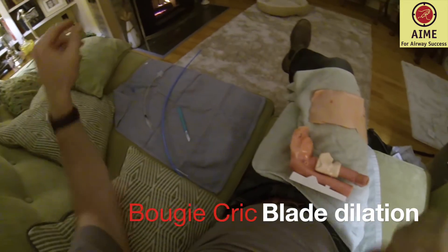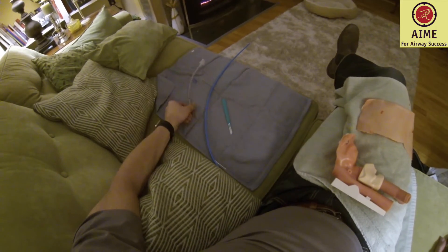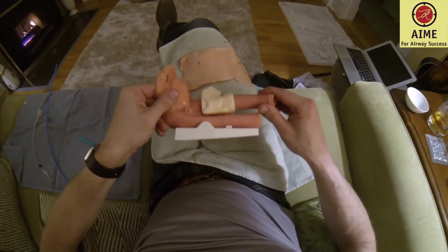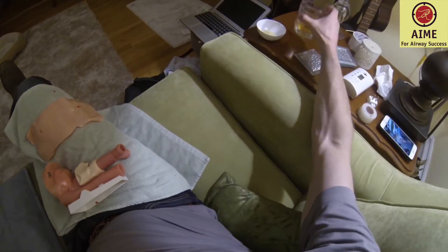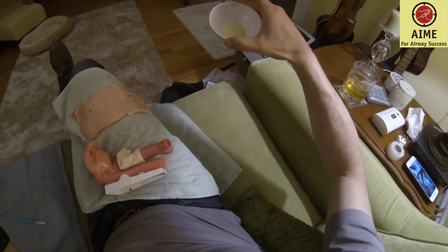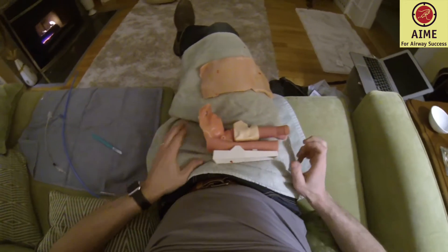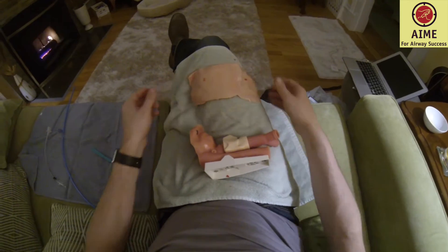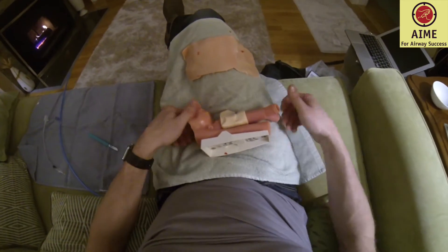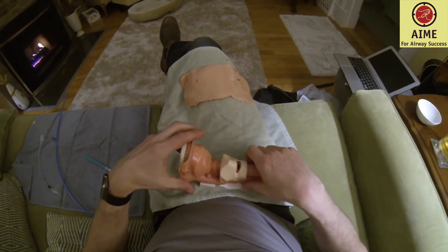Hey folks, it's George Kovach here. You're in my living room. I've got a fire in the background and I've got my surgical airway equipment here — a number five and a half tracheal tube, a bougie, a number ten blade, a neck model, a neck skin, a glass of Irish whiskey, and some olive oil to lubricate my equipment. I just wanted to talk about the surgical airway, and we've had a few success stories communicated via Twitter and email of people who've done tremendous jobs rescuing patients in need of a surgical airway.